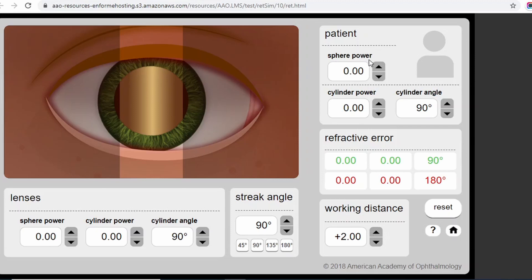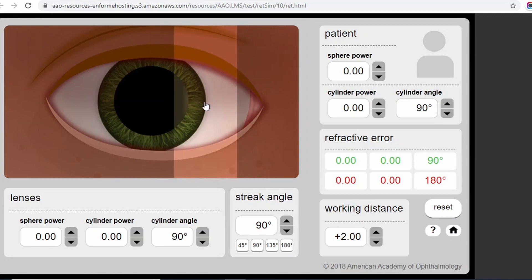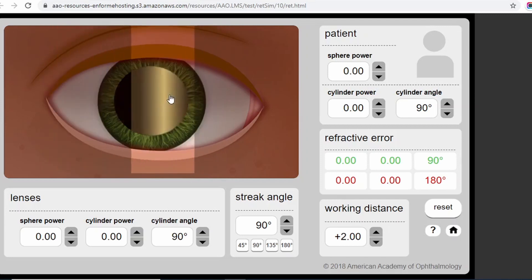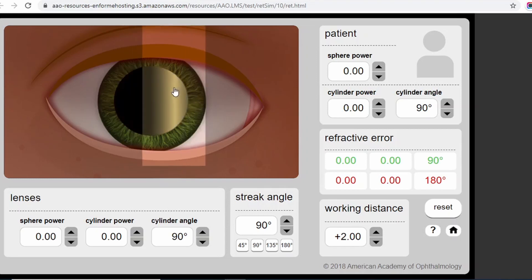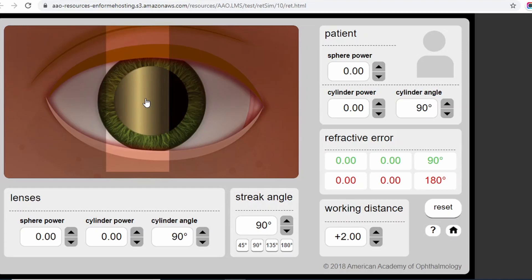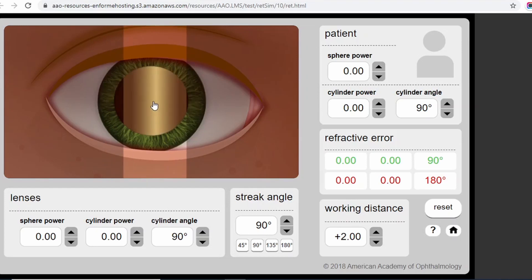We use retinoscopy to identify the refractive error — myopia, hypermetropia, or astigmatism — and state the refractive power of the patient. Here I have set my working distance to 2. Here are the patient details: spherical power, cylindrical power, cylindrical angle — all at zero, meaning plano power. Remember, when you do retinoscopy, if the reflex is dim and slow it means you are far away from the neutralizing point, and if the reflex is bright and fast it means you are close to the neutralizing point.